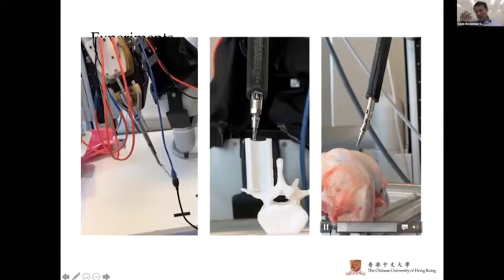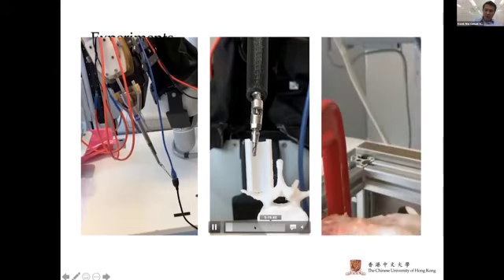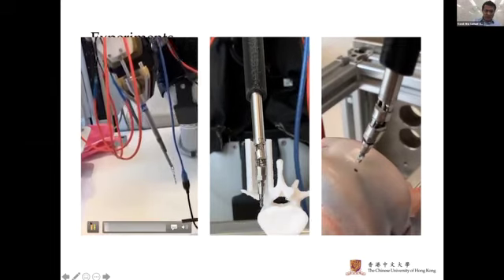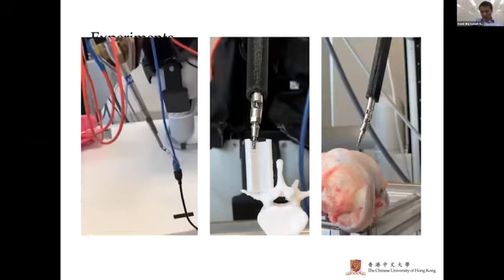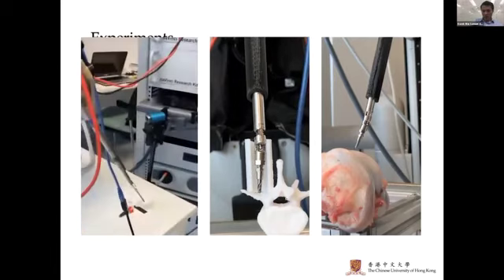This instrument is about 6.5 millimeter, and the surgeon is doing teleoperation using the same dVRK interface. You can sit down like at a Da Vinci robot, do teleoperation, and do drilling, and you can see we can articulate the drill to go through some tight bends. This is another video. You can bend around the joint using the standard Da Vinci interface. Right now we are building another version, around 4.5 millimeter in size, to tackle spinal surgery or ENT surgery.